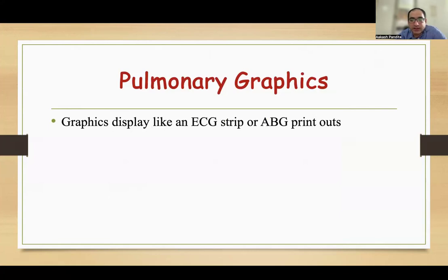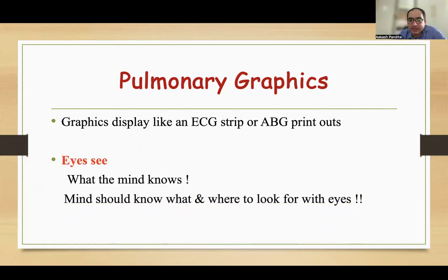So remember that pulmonary graphics are just like an ECG and ABG printout. They give you a real time assessment of the settings, the baby's condition, and lung conditions. They also help us identify misadventures before they become a catastrophe. So always see the graphics. I hope after this lecture, you will go back to your patients and start looking at the graphics.